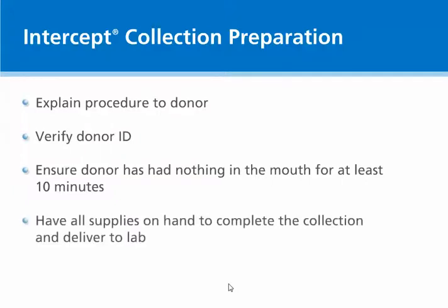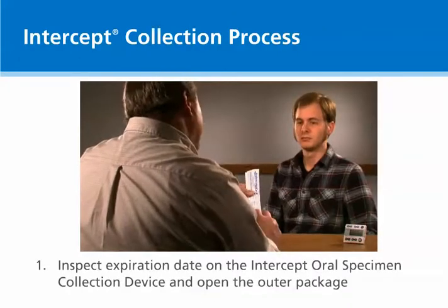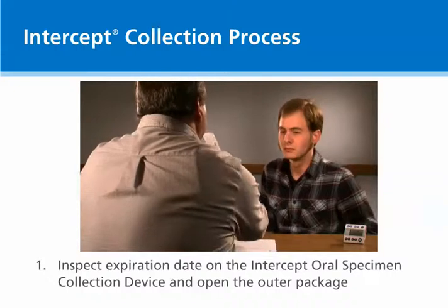Have all supplies on hand. This includes the Intercept collection device, Intercept collection procedure card, lab specimen bag, lab chain of custody form with tamper seal, a timer capable of timing at least 5 minutes, and any shipping supplies needed to get the sample to the lab. Check the expiration date on the outer packet of the Intercept collection device before proceeding.